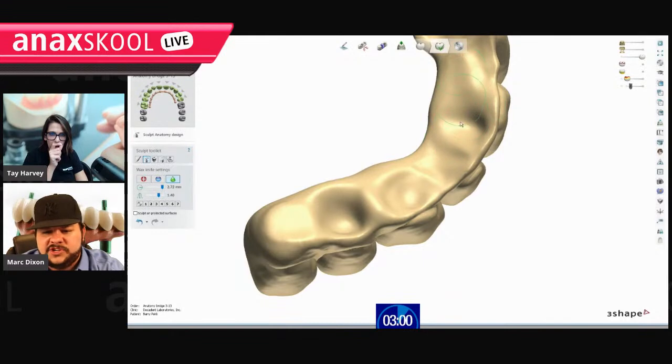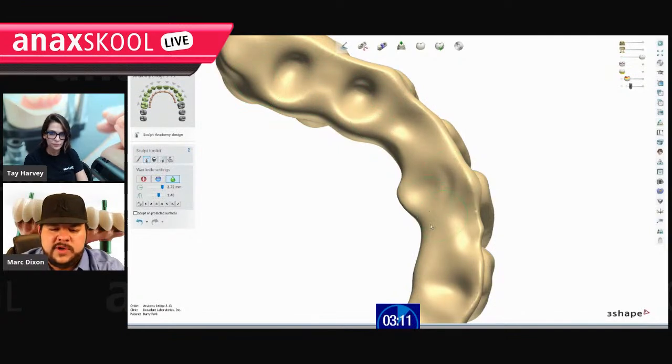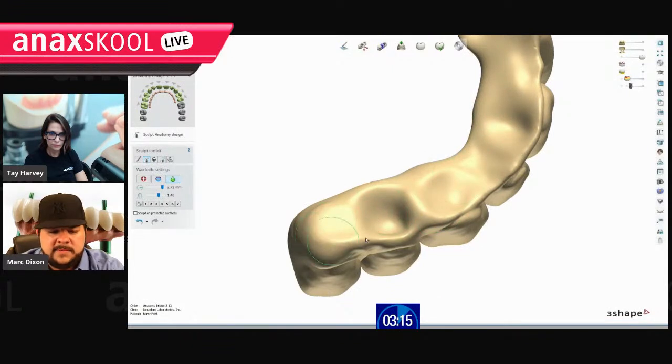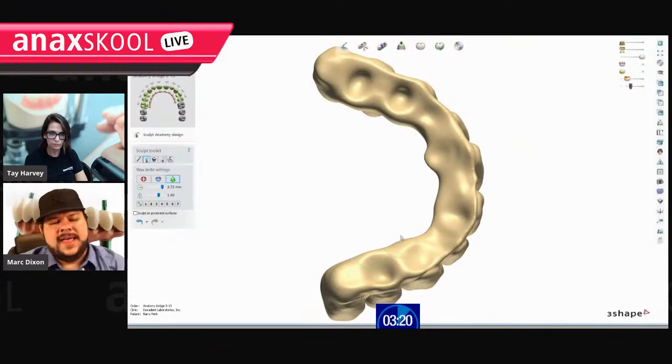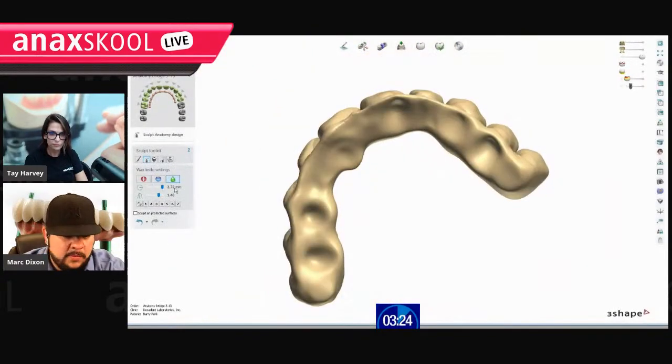Our supragingival connections. I didn't want the surface intersecting. Oh, yeah, you were talking about that and you skipped on it because you wanted to save some time. Now I remember. Well, 3Shape users know that when you hit sculpt on protected surfaces, those areas just around your implant interfaces, your Ti bases and stuff, they don't sculpt well at all. And we're going to see that now. But if you keep them from intersecting the surfaces, then they do sculpt very, very well.